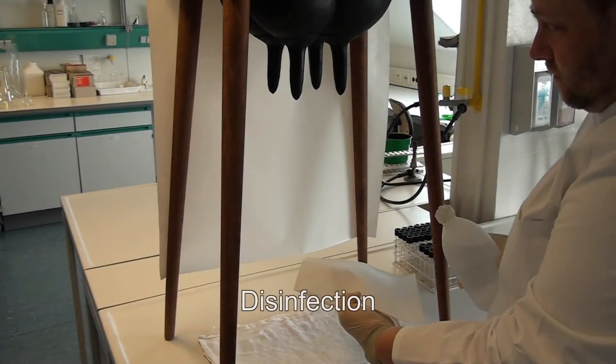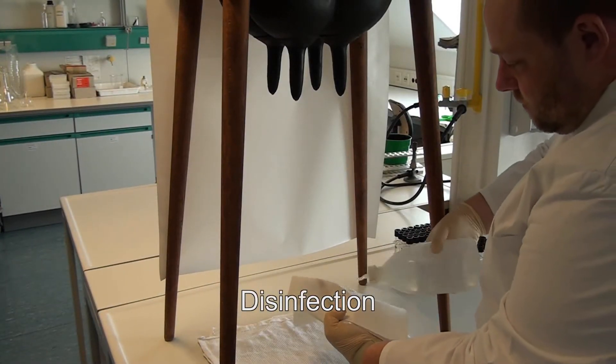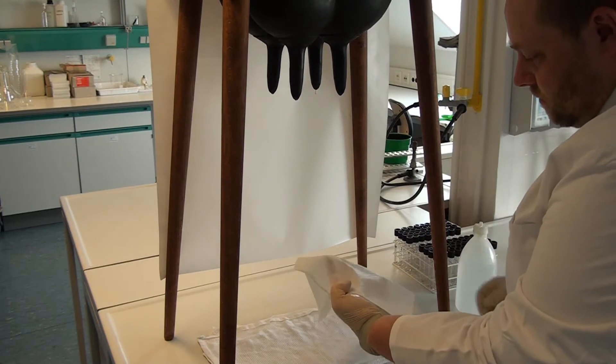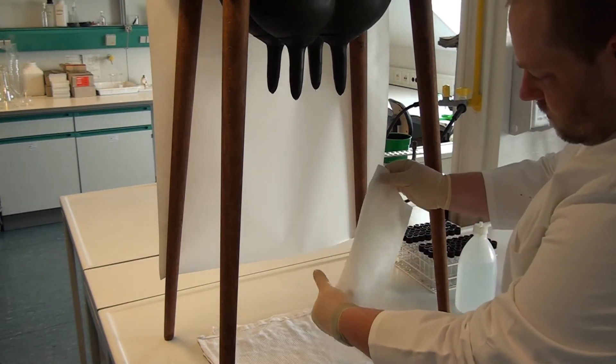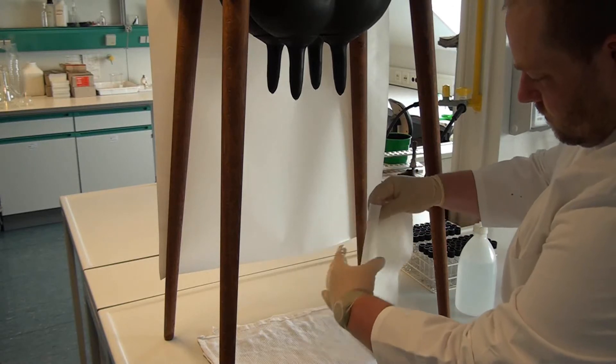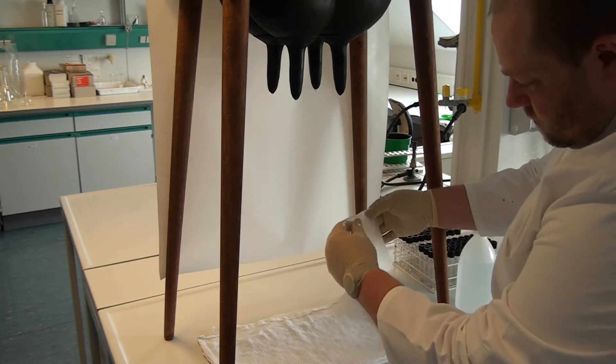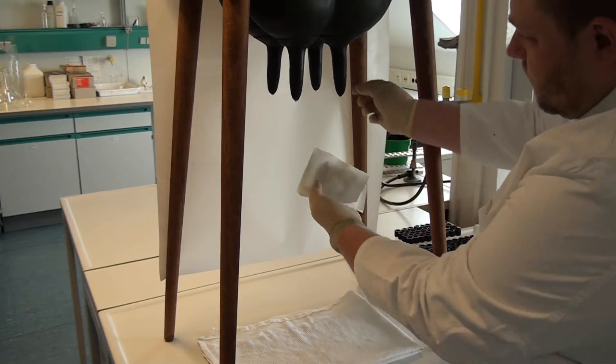By now, teats should be ready for milking, meaning that they appear plump and are warm. To disinfect them, either single paper towels are used for each teat, or towels are folded in a simple way as seen here. In any case, towels must be soaked with alcohol.